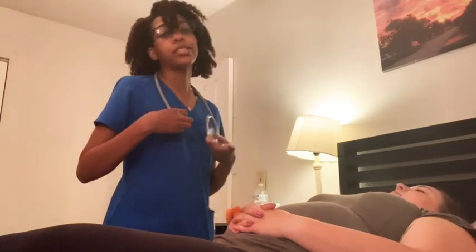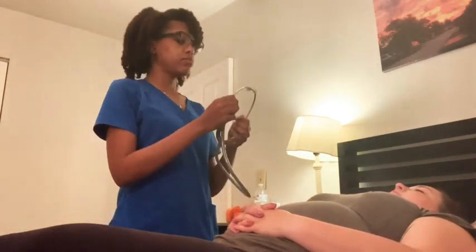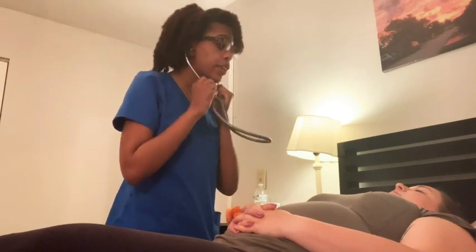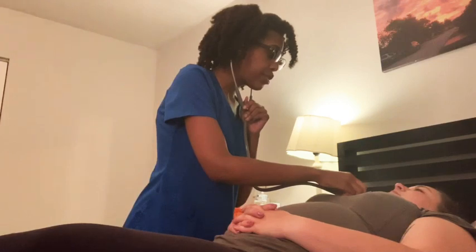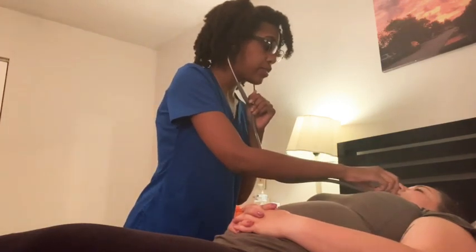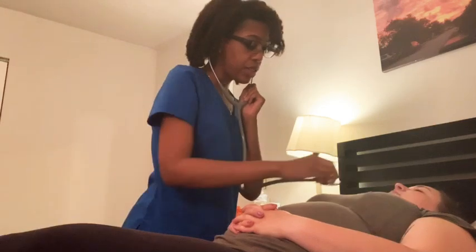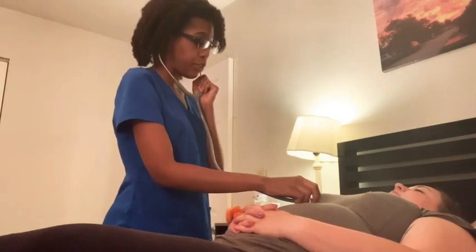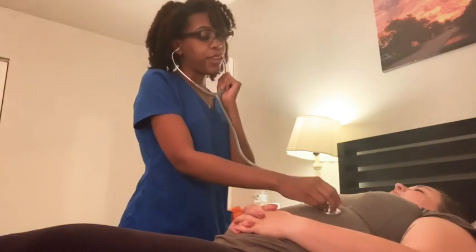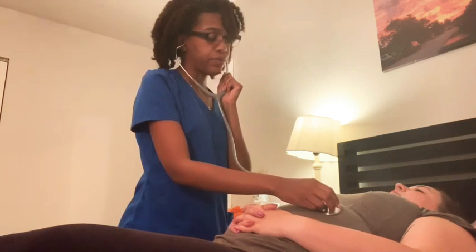I'm going to be using the diaphragm of my stethoscope. I'm going to be listening for your aortic valve at the right sternal border, 2nd intercostal space. Your pulmonic valve is the 2nd intercostal space, left sternal border. Your tricuspid valve is the 4th intercostal space, left sternal border. And your mitral valve is your 5th intercostal space, left midclavicular line.